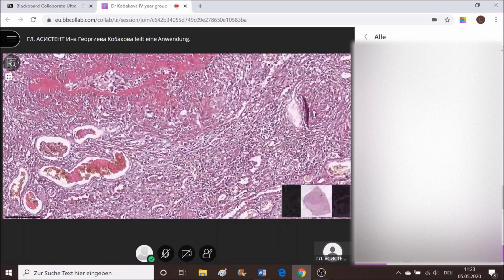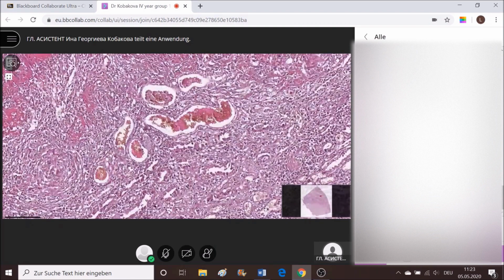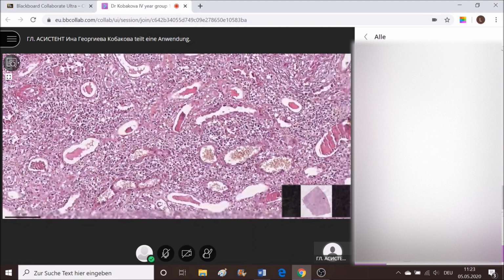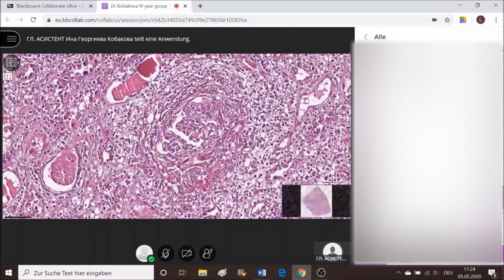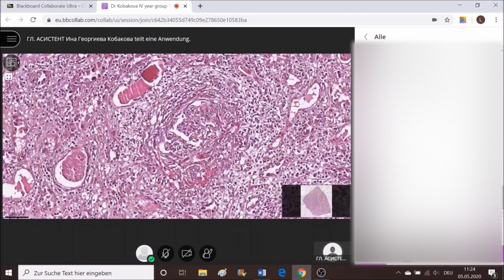What we should observe here would be the picture of the glomeruli and how they specifically are looking like. Now, let's find the representative one. Now, what's the difference between this one here and the ones that I showed you just a minute ago when we observed acute kidney failure where the glomeruli had not been affected by the process? Here we have effect of the glomerulus. Now, search for another one, even more representative of the process here.